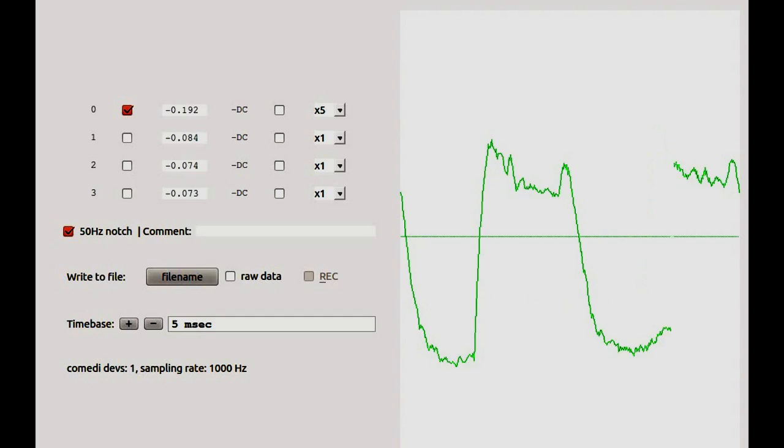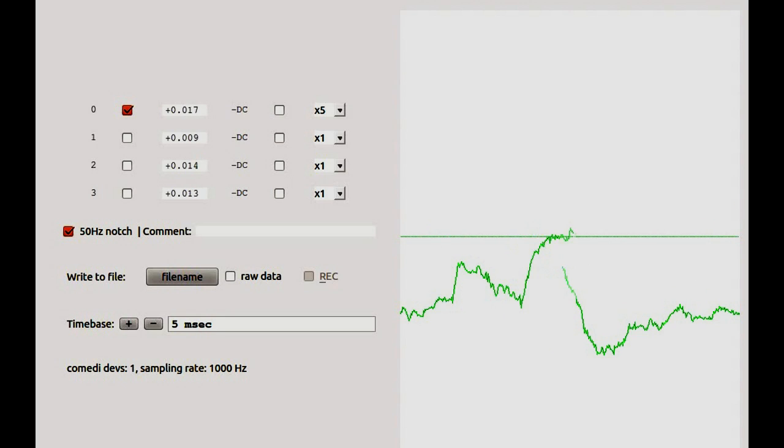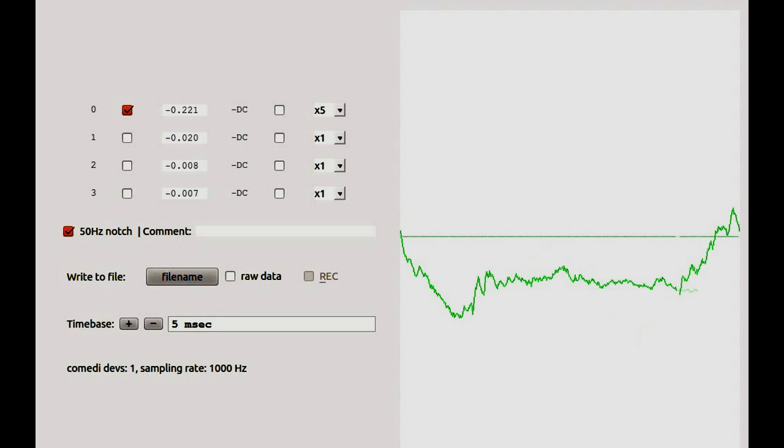What other artefacts do we have apart from this then? Okay. What else can we show? Well, we can show the eye movement artefact quite simply. Okay. So if you just look up and down, right to left, we should be able to see again a change in the signal. Yeah, you can see a change again. So we've demonstrated two artefacts now. We can try and reduce these and try and now see a bit of your EEG.